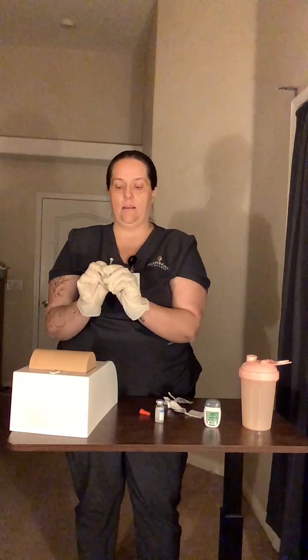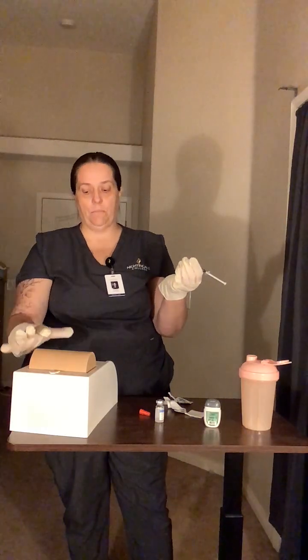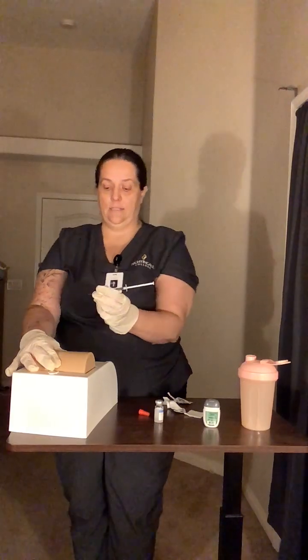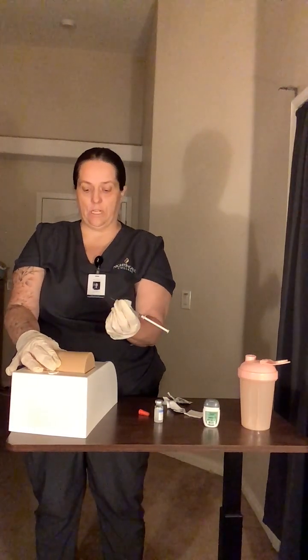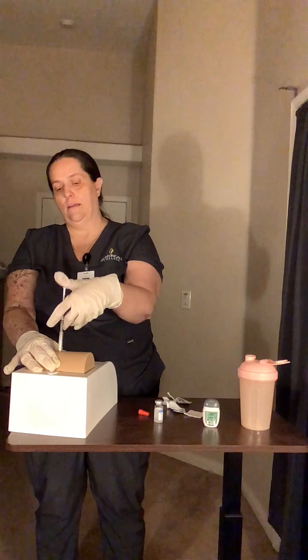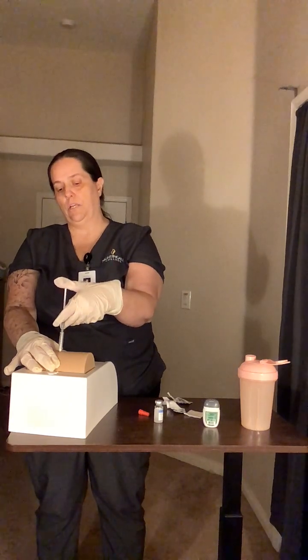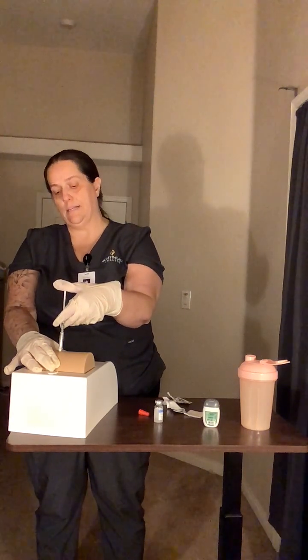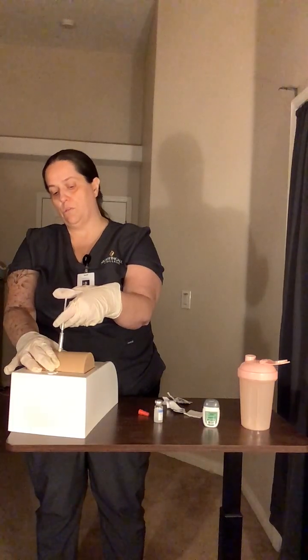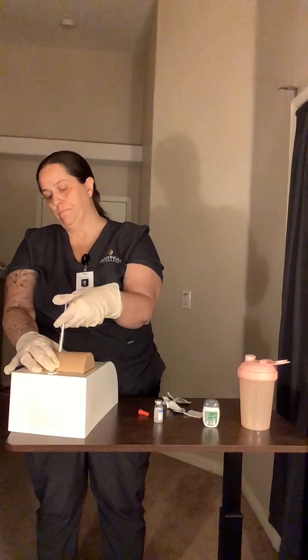I'm going to take off the lid. I am going to put it at a 45 to 90 degree angle while pinching the skin. I did measure it to make sure that it has enough skin to give the injection. I'm going to go in at a 45 to 90 degree angle, straight in, pinching the skin the whole time, and then push in the injection within 30 seconds, slowly pushing it in. This isn't a medication that we want to just push real fast.